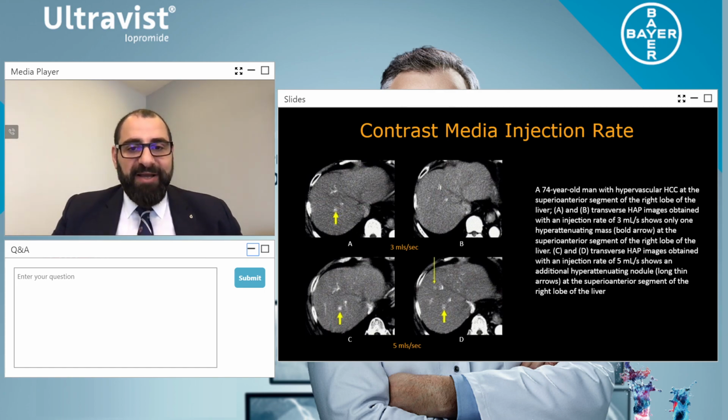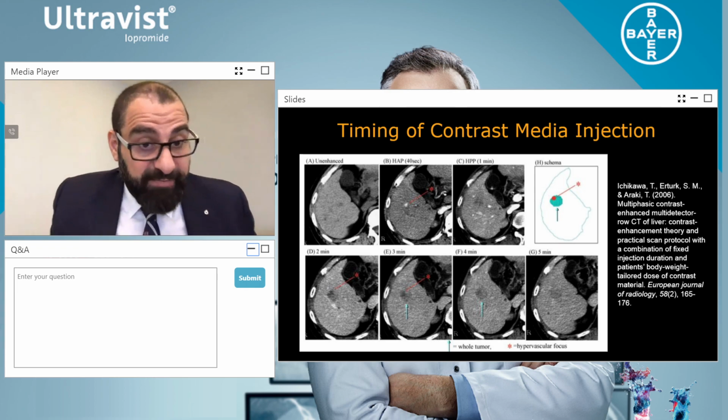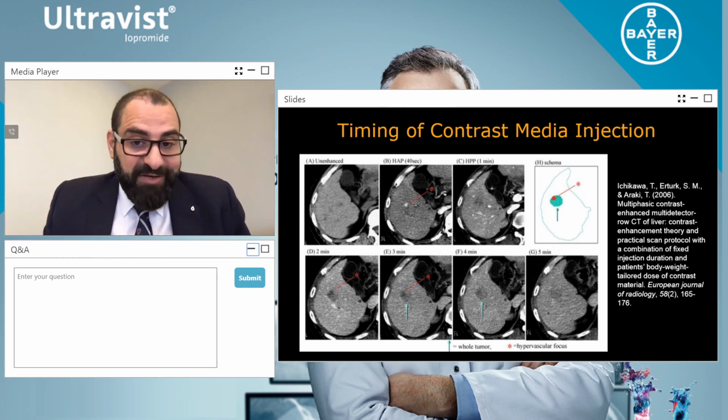If I go to my next study, the importance of timing is that when we're looking at washout. Now, someone said to me, okay, I think it was James Miro, and James, the LI-RADS said 3 to 5 minutes, which was a fantastic question.